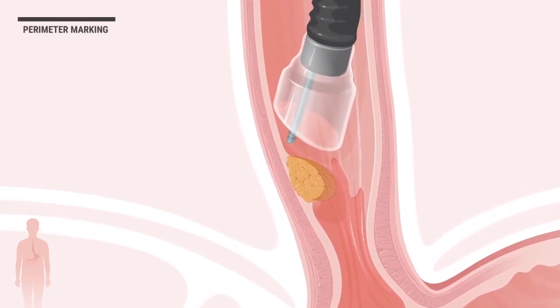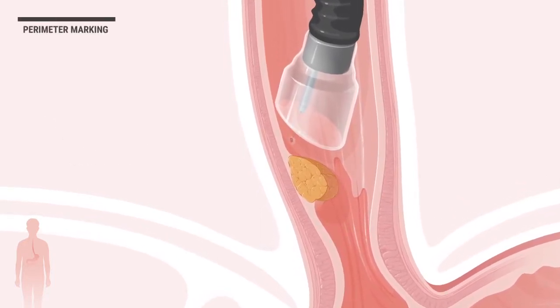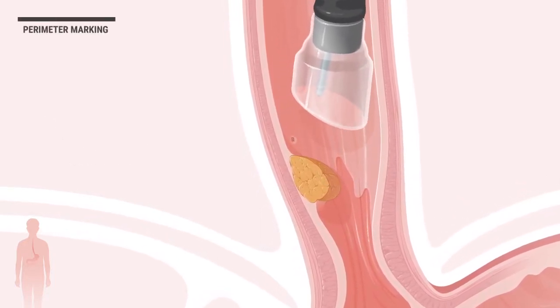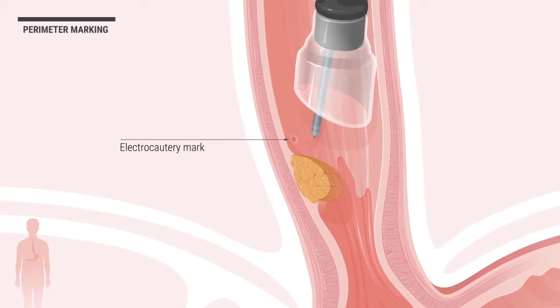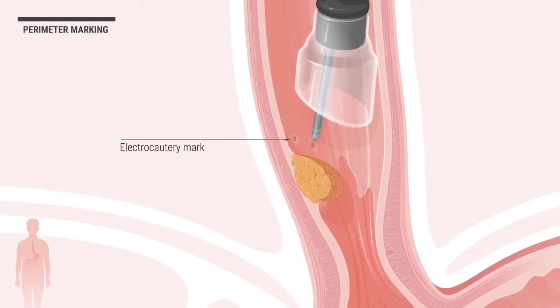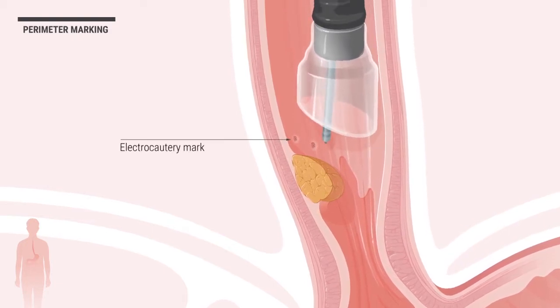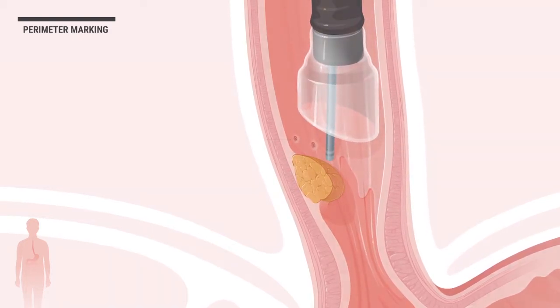First, the perimeter of the tumor or abnormal tissue is marked, defining where the cut or incision will be made.